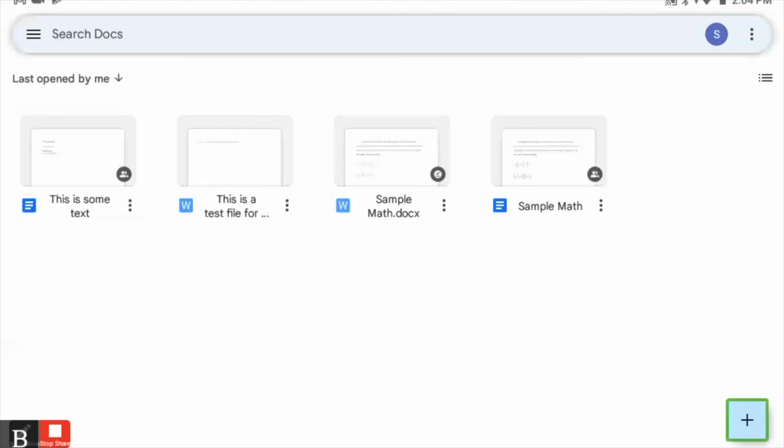So instead of pressing C, because I was way off there, I'm going to press the letter N for new document. New document menu, button. There we go. You may have heard it just jumped straight to the new document button, because that, in my case right now, happened to be the very first thing that started with the letter N.